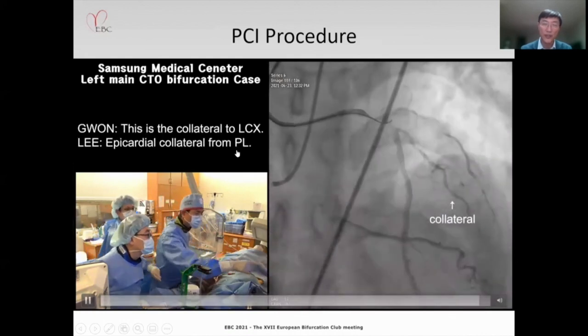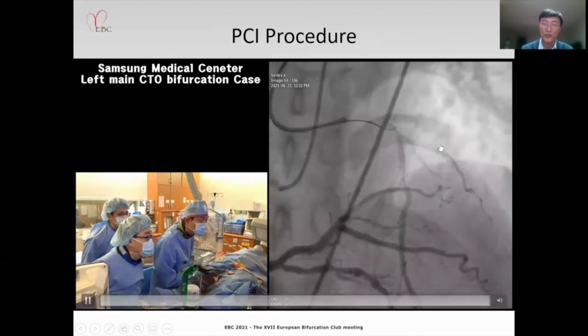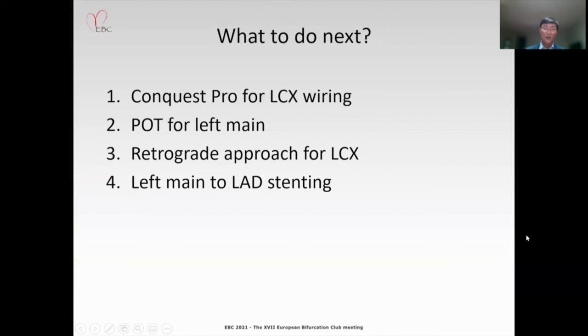And the next thing we considered was a retrograde approach for circumflex. But unfortunately, circumflex is supplied by very tortuous epicardial collateral. It's nearly impossible to travel. So circumflex totally occluded and very complex collateral circulation. So what to do next?